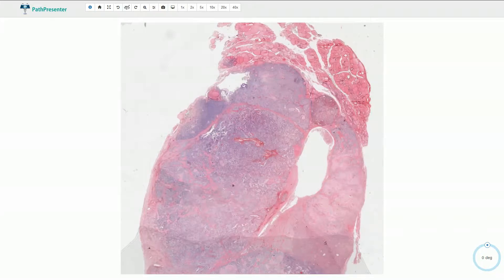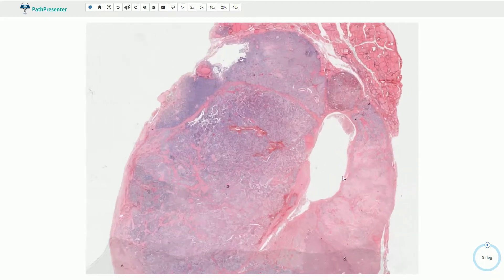Thyroid medullary carcinoma is a malignant tumor of the thyroid gland derived from the C cells or parafollicular cells, which are the neuroendocrine cells producing calcitonin. This is the residual parenchyma of the thyroid gland, and here we have the tumor.